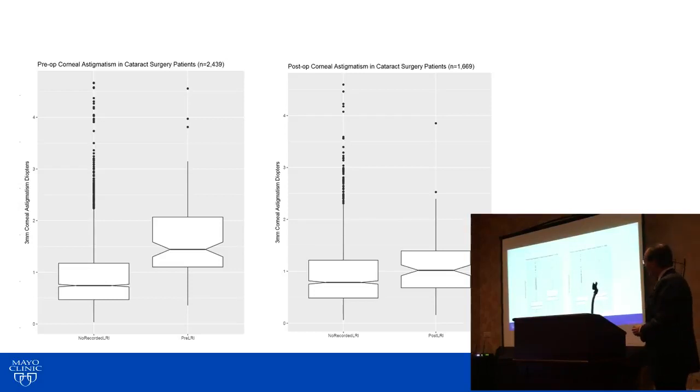And if you think about it, the way we implemented LRIs in our practice is, like a lot of things we do, we are very conservative. We're conservative with our nomograms, we're conservative with our incision depth, and it is reasonable, and usually conservative is a good thing. But I think we're probably over-conservative here, and this would suggest that we have to look at our practice a little bit in terms of how we're doing this. So this is pretty good feedback or data.